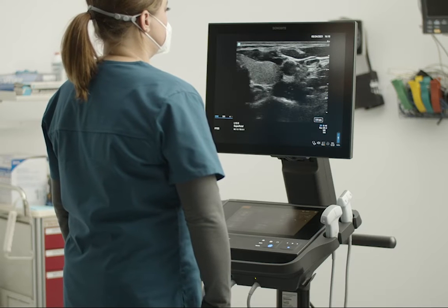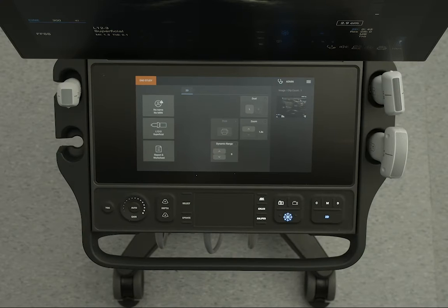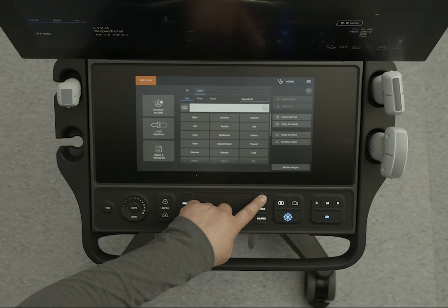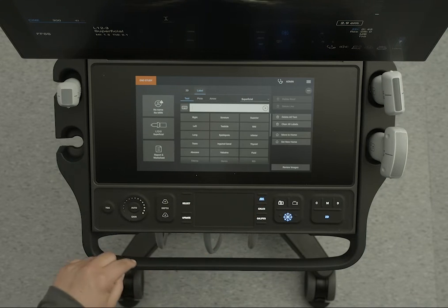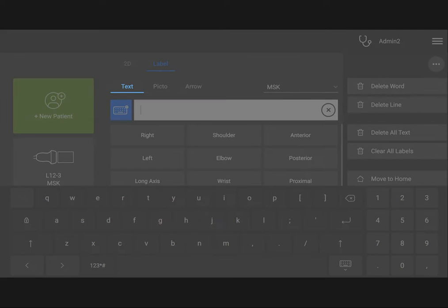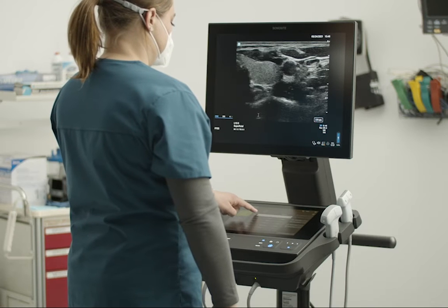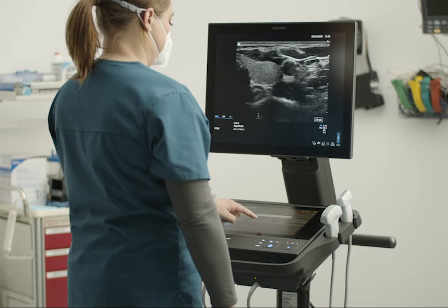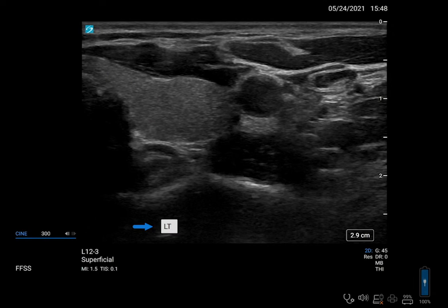First, let's create a text label. Press the Label button to access the Annotations page. You'll see several options on the Annotations page. To add a text label, select Text. Now, type in a label. Notice that the label appears on the clinical monitor in the default home position.